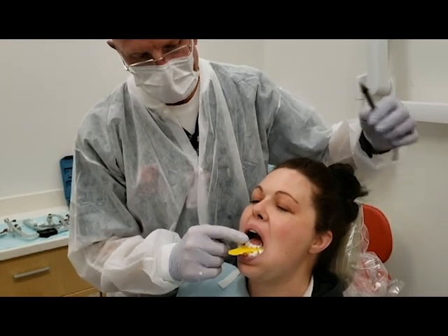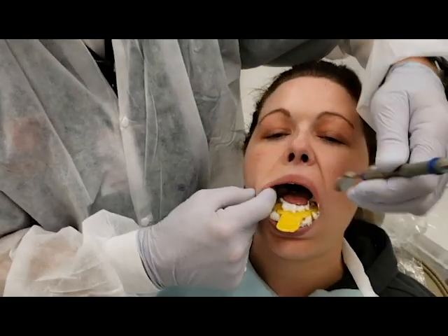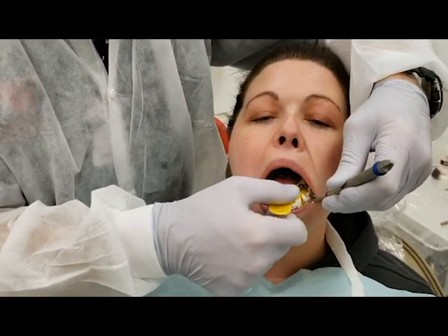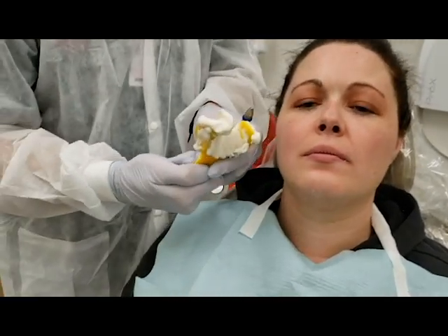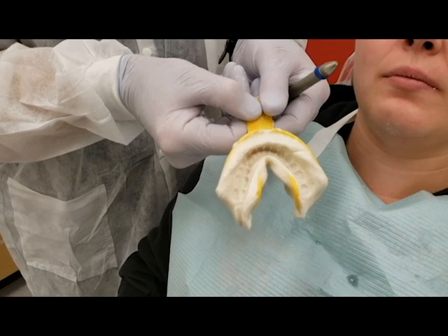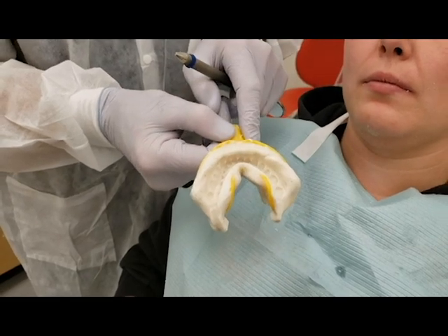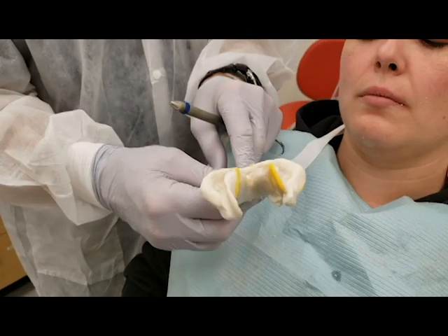The material is set. Again, we'll get a little bit of air release on either side. Keep the mirror there for when you take it out. And again, we should have a fairly decent impression with good extensions all the way around the vestibule area, so that we're not just looking at teeth sticking out of stone blocks.